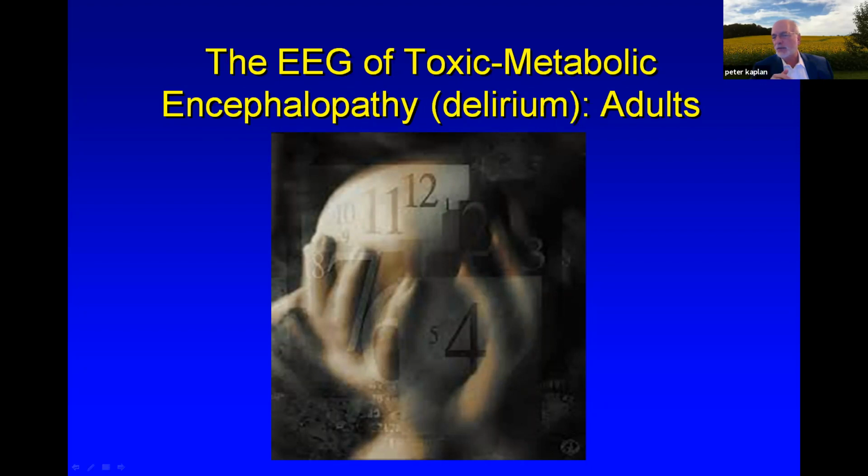So for example, if you have frequent discharges and the patient has had as a cause intracranial or extracranial hemorrhage or stroke, then there is evidence that treating intensively improves outcome. If you have patients who have some of these discharges, but they have much more benign findings, let's say they are even in absence status, those are not brain damaging, and therefore you will tread more lightly in treating it. So it's not the EEG where it stands along the continuum in isolation, it's what's causing it and how deeply obtunded the patient is.